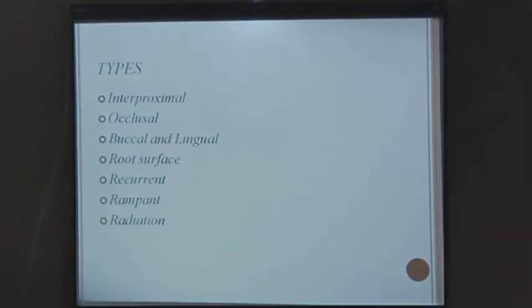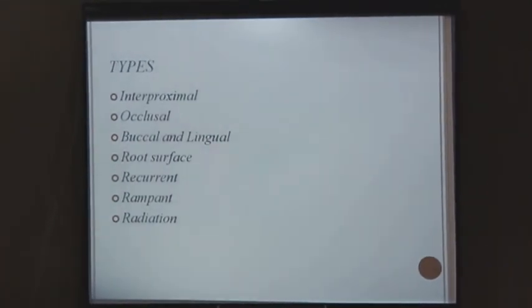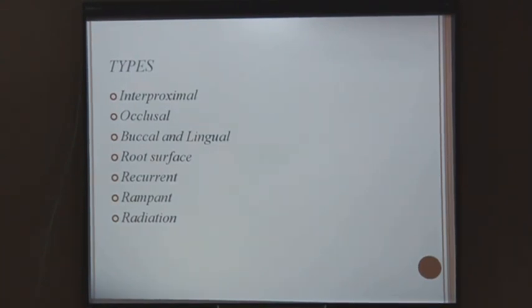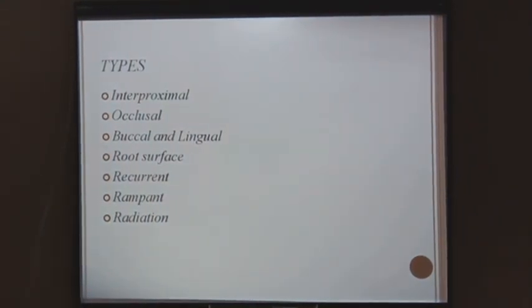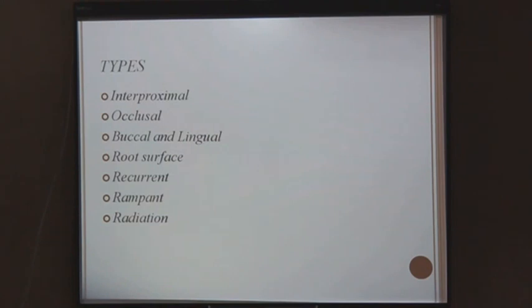There is something called subtraction radiography. For that, 5% of mineral loss is sufficient to produce a defect. Okay, that is an MCQ question. There is a range for mineral loss, 30 to 50%. So if they give you 30% or 50%, both the answers are correct.